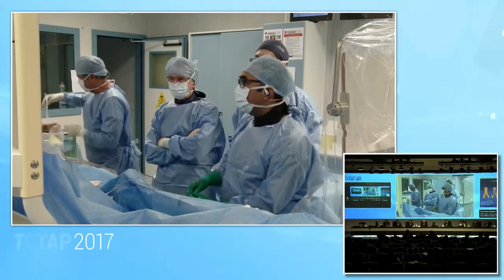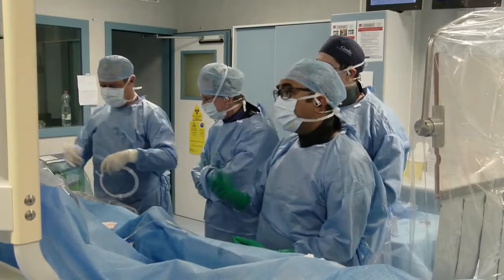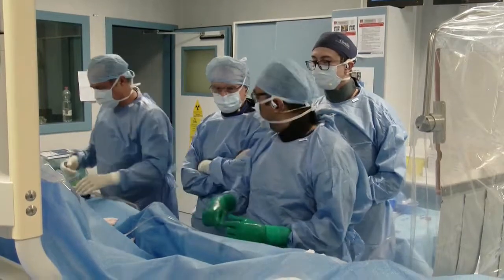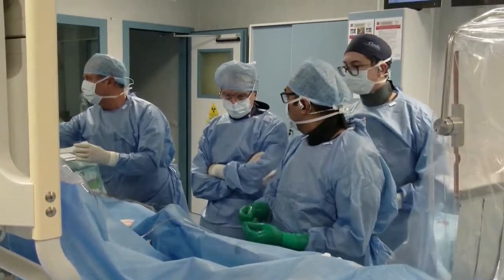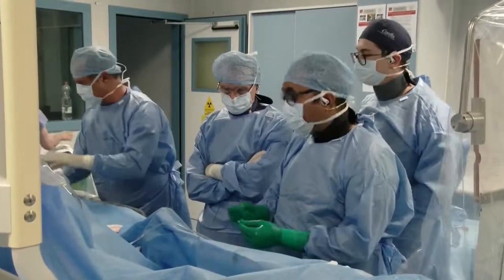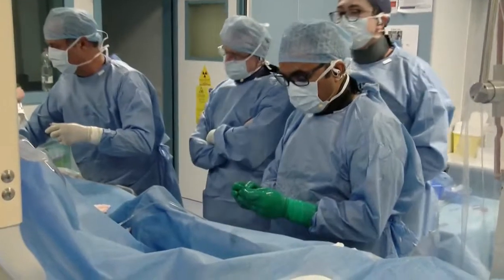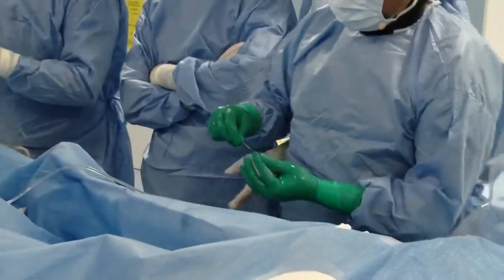I have to admit, when Antonio and I discussed the case before, I was keen to do a stent. After seeing this result and the IVUS, I think a drug-coated balloon is very acceptable. There's no flow-limiting dissection. The residual lumen area is very good. It's like in the old times when we did spot stenting. I use IVUS to evaluate.